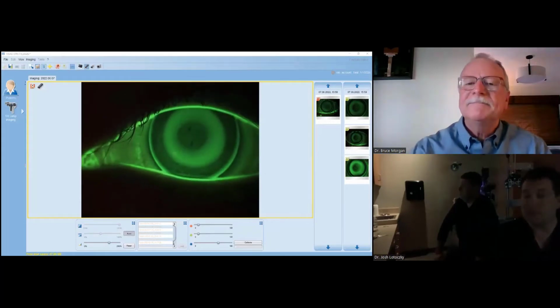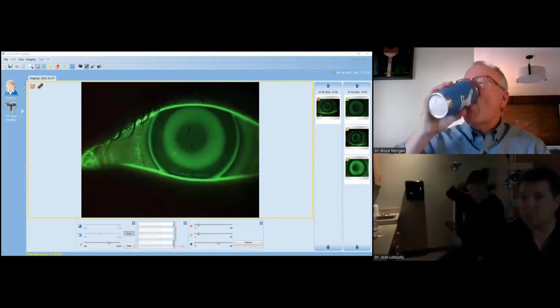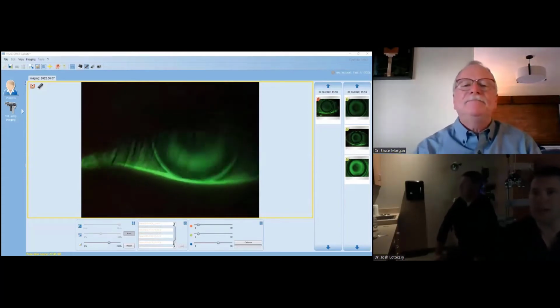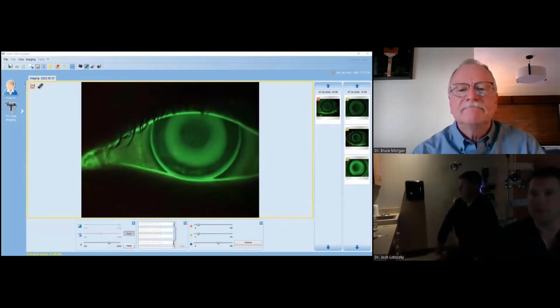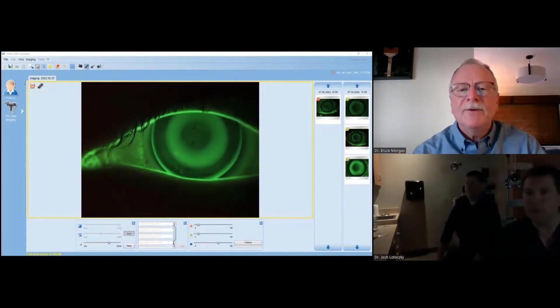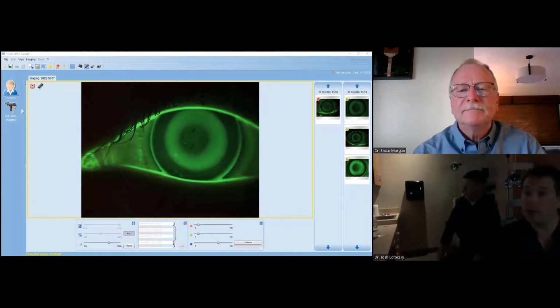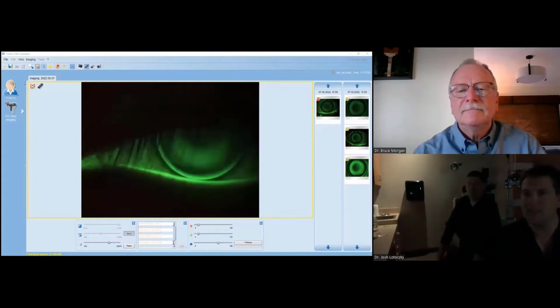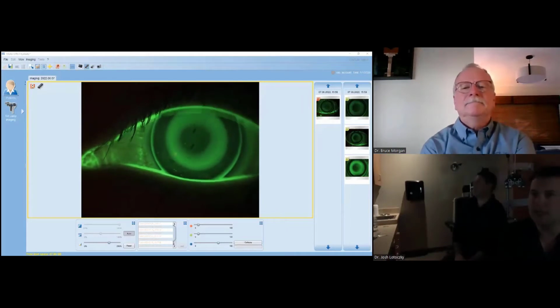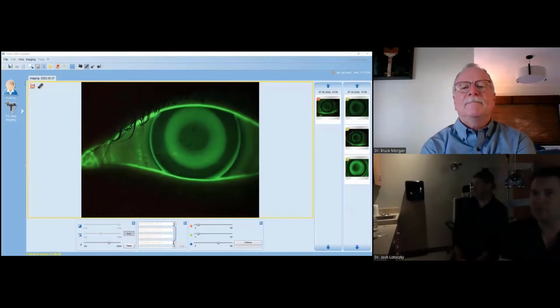Yeah, that's a great point, because the more correction you're going for, naturally, the smaller the treatment zone you might actually get on the cornea when you're taking the topography and evaluating it. We can only move so much tissue. But if you're a low myope and this is a -1, then I probably would say, maybe we want to see if we can get a little bit closer, because I think the area that the treatment's going to be compressed in that cornea can be a little bigger than that. But it really is going to depend on your scenario for sure.